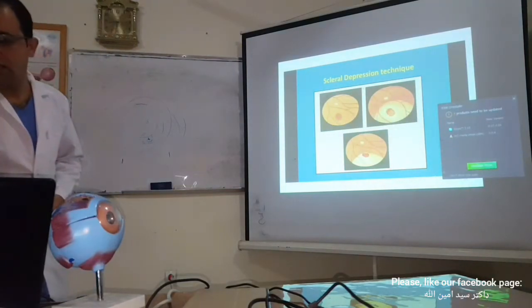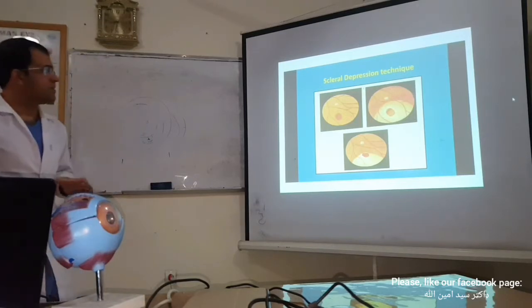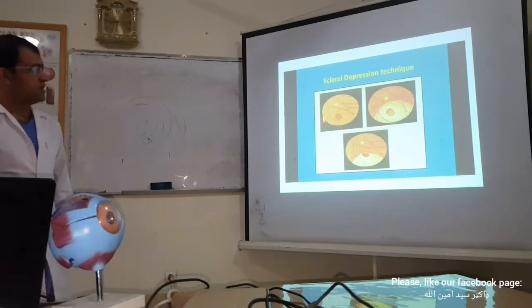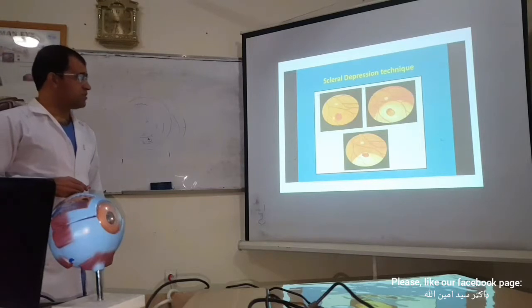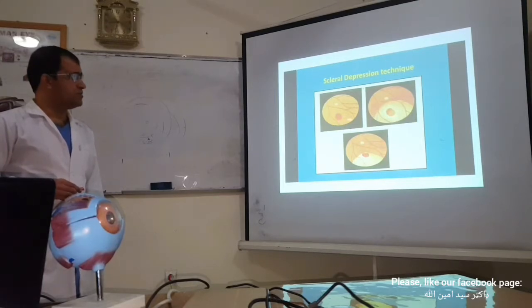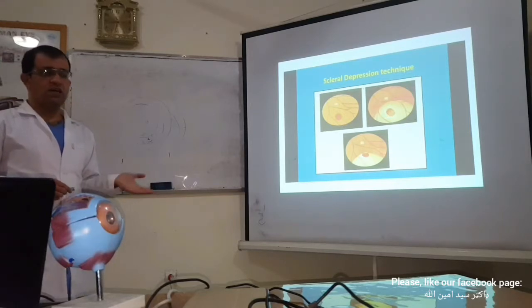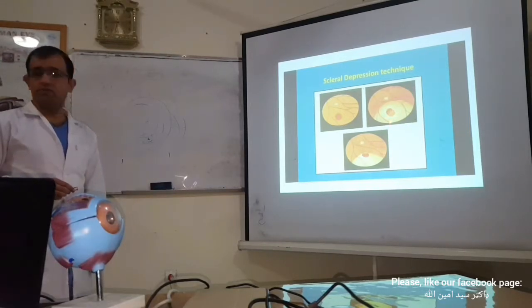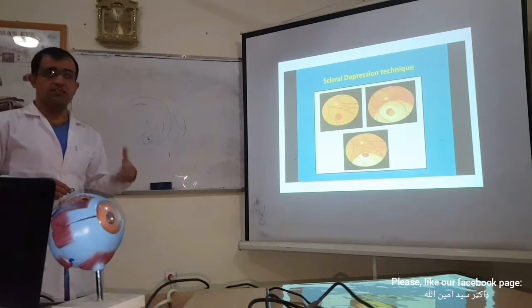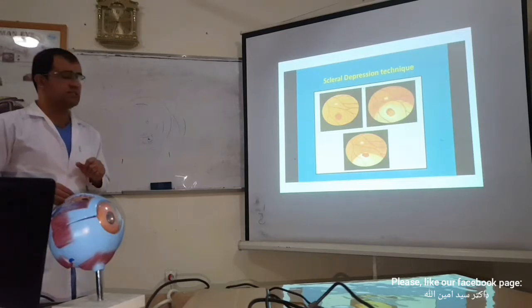And this is the picture of the scleral indentation. In the first picture you see that without indentation, this kind of lesion, the images are old, it looks like this. By the indentation, we may see more aspects of the lesion. If we indent the lesion, then we will understand the depth of this lesion, whether it is excavated or not. So sometimes we have to indent the sclera.